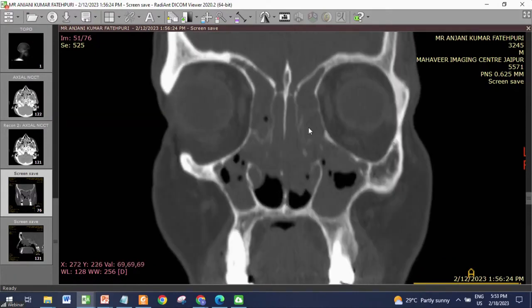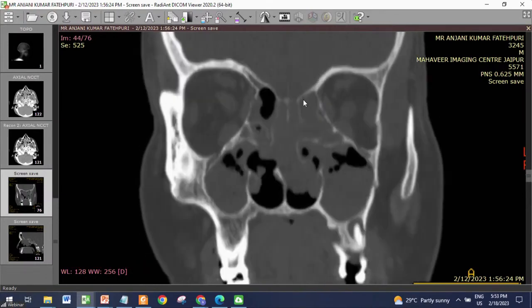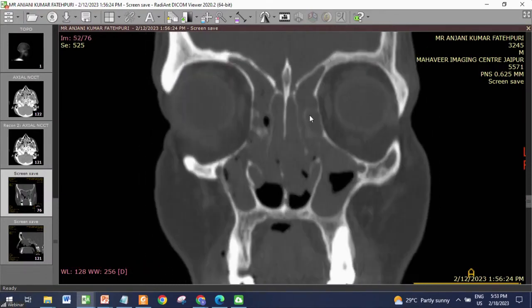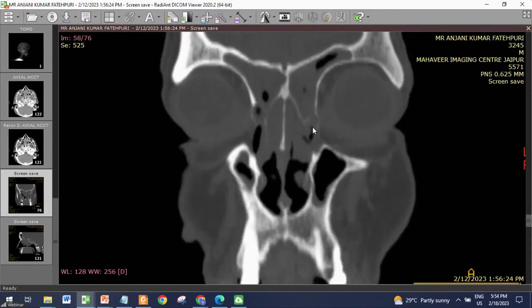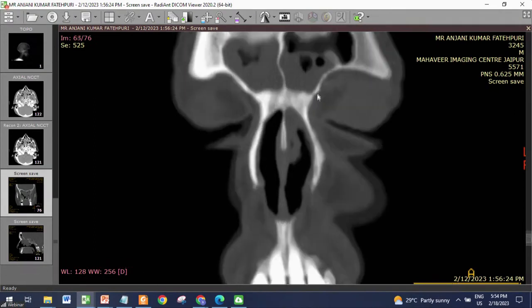Any questions? Sir, right frontal drainage, can you describe, sir, please? Right frontal drainage is hardly any challenge. See, the challenge is that ethmoidal artery, an important finding, supraorbital recess anterior to it, frontal sinus. See this, anterior to posterior, how to go.